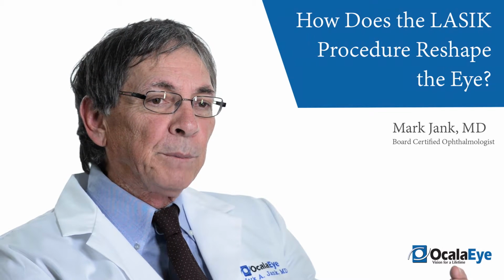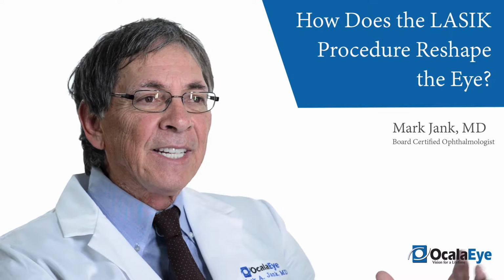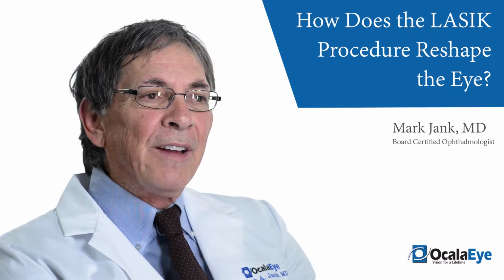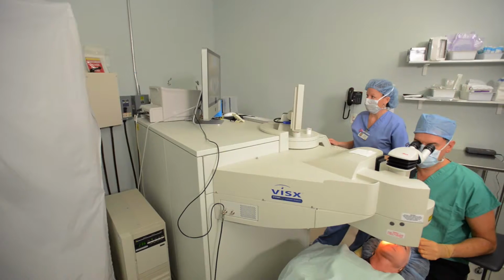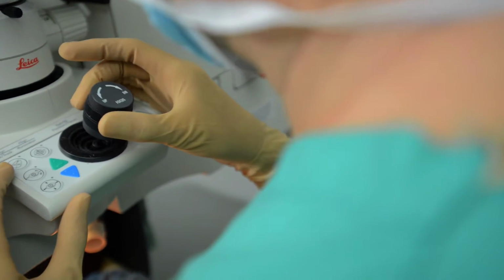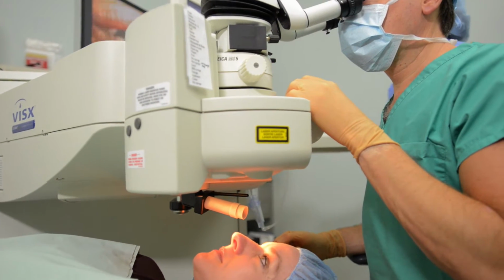When the treatment is being performed, you just hear a tapping noise. It kind of goes ting, ting, ting, ting, ting, like that. And that's it. It's completely painless. People in general don't have any trouble looking at the red light. It's not overly bright or anything. And it's the surgeon's responsibility to keep everything lined up and focused and centered correctly, and make sure the patient is calm and not moving.